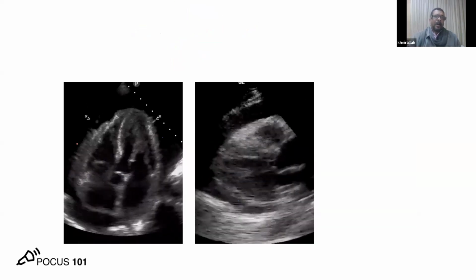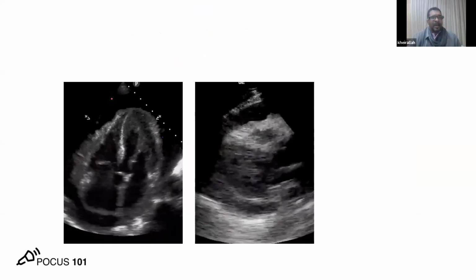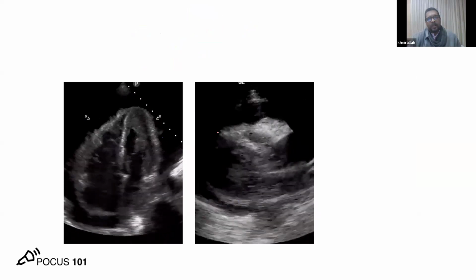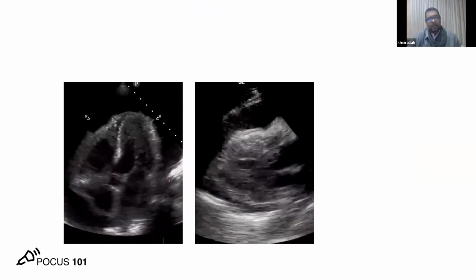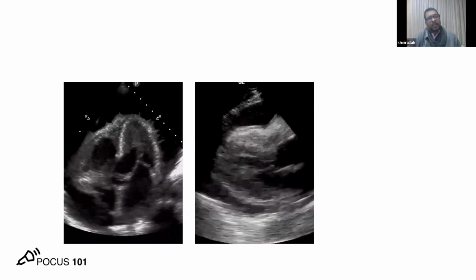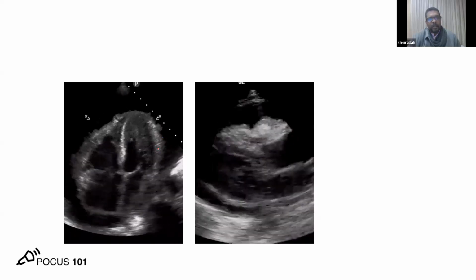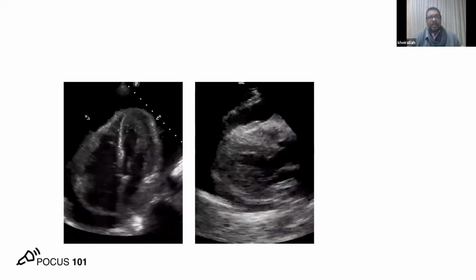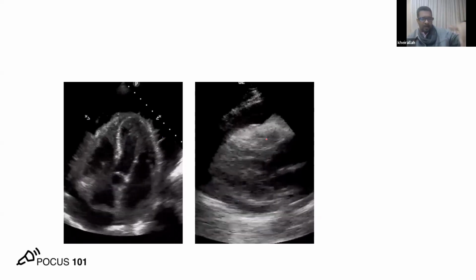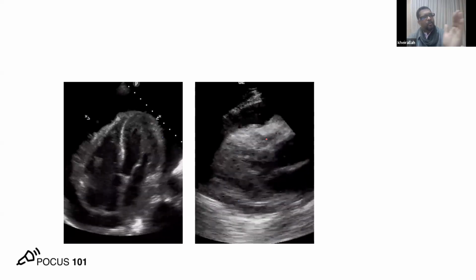طيب, here we have a heart and we have large pericardial effusion around it. And as you see here, this is large pericardial effusion. Again, the image quality isn't good, but expectedly because of the patient's condition with this tamponade-like presentation, because we see that the RV is collapsing. Don't worry about the words I'm saying now about the echo, because we are going to study each one separately.